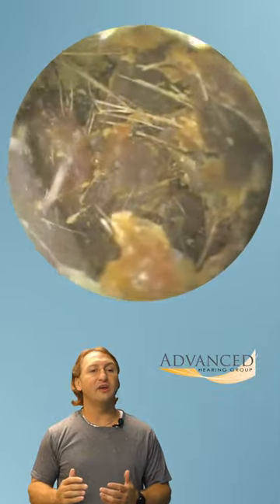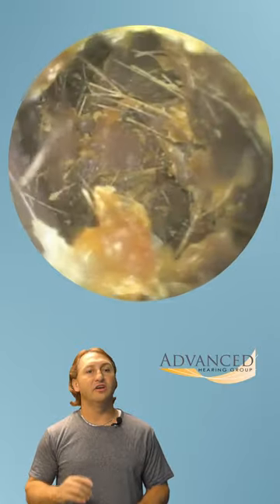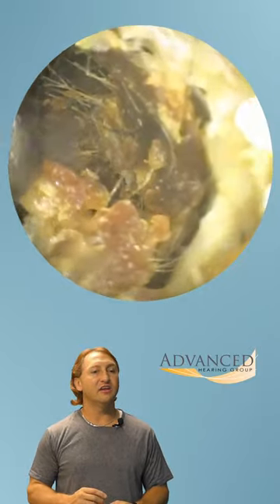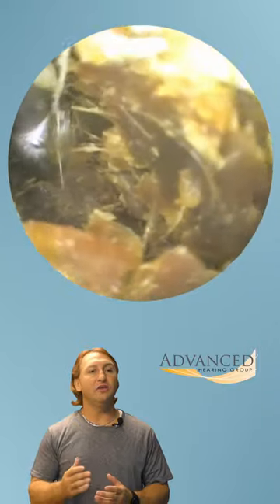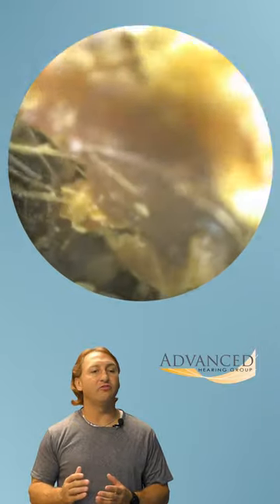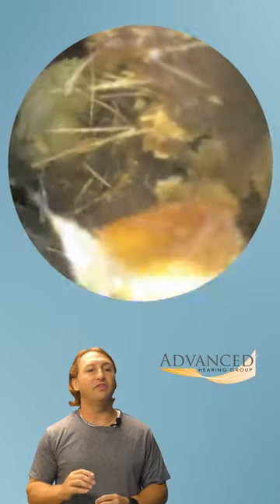You can see we're using the curette to remove this hard earwax, and it is indeed stuck to the ear canal walls. I'm going to use the curette to get at the bottom of the earwax, peeling it away from the ear canal floor, and it's going to give us just a little view of that eardrum.